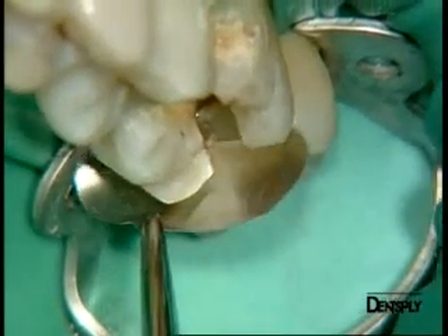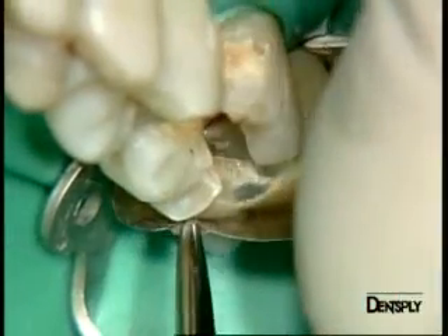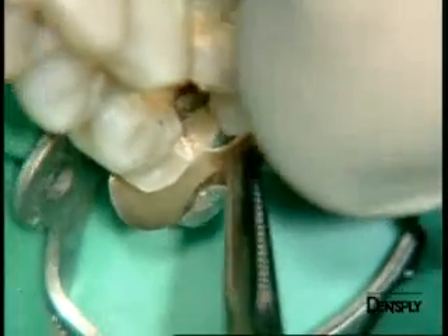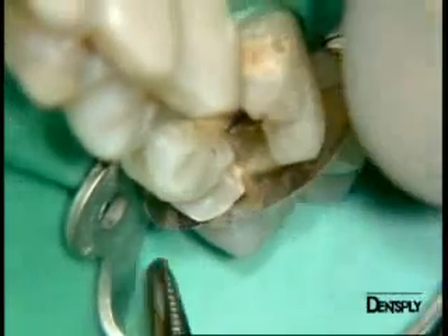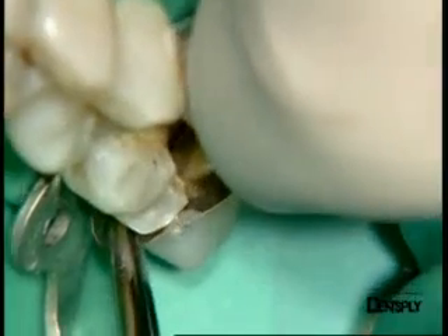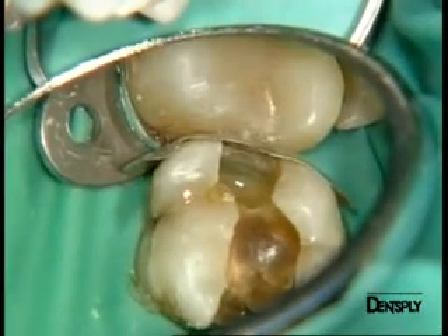We now place the Paladin matrix to reconstitute tooth six. The matrices will be inserted distally and mesially using tweezers. These matrices are very fine to facilitate the reproduction of the contact point. You can see the matrix being fitted to the distal cervical wall. The curved form facilitates the anatomical reconstruction.